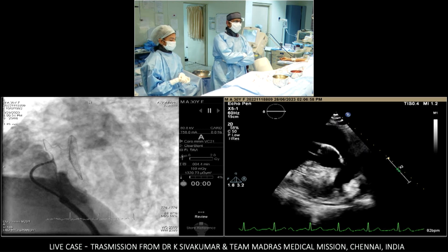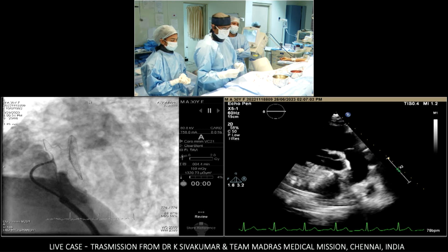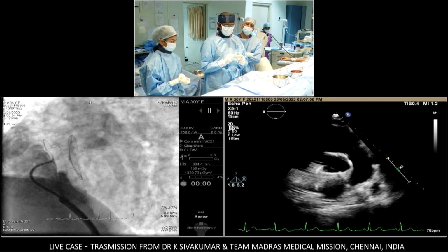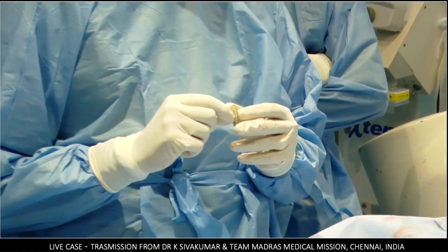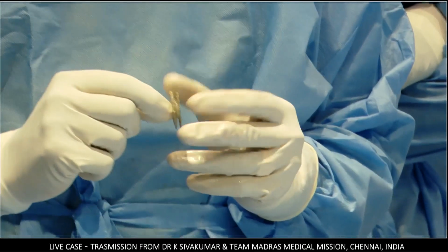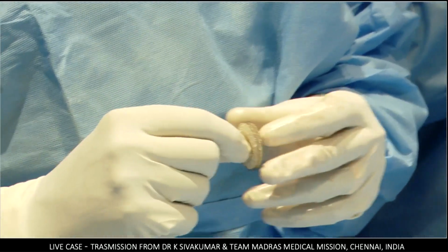Thereby making the inventory a little less, and in this process he is also trying to make the screw end a little longer, and probably tries to avoid a difference between the LA disc and RA disc by making it more similar. I should be given another 1 to 2 years of experience with this particular product to comment more. This is the first time I saw this device, about 4 days ago, and we are using this today.